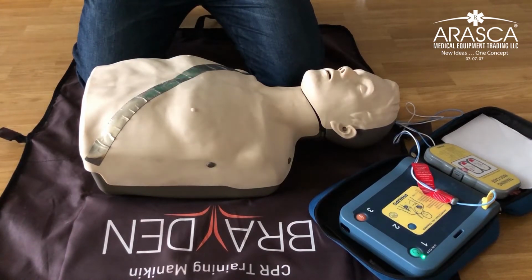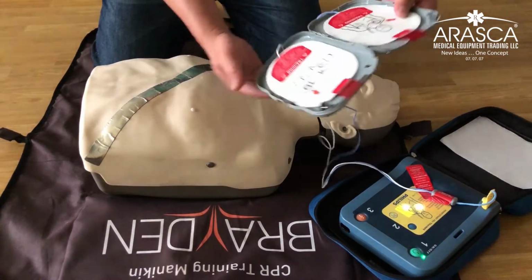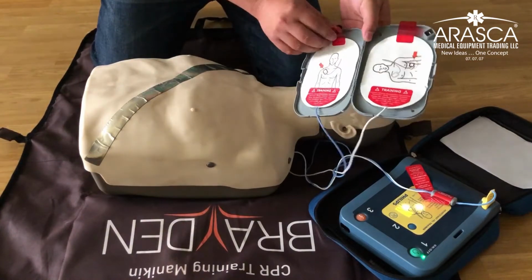Patient's chest. When patient's chest is bare, open grey plastic case and peel off white adhesive pads. Look carefully at the pictures on the white adhesive pads.